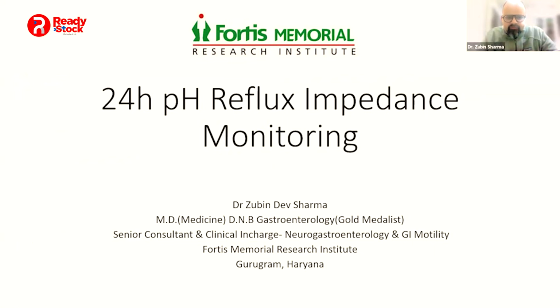So, first and foremost, you must have covered esophageal manometry, and you covered anorectal manometry prior to this. So 24-hour pH reflux impedance monitoring is something which I believe is still not appropriately done, because most of the time, in fact much more than even manometry, we are dependent on the automated reporting done by the machine. And let me tell you, exactly like manometry, the automated reports provided by the 24-hour pH equipment, irrespective of whatever equipment you are using, are not very accurate.